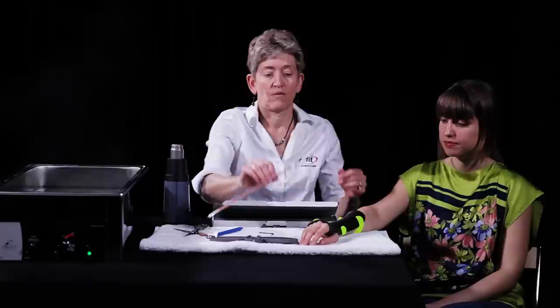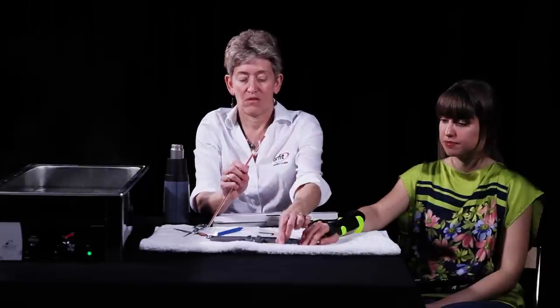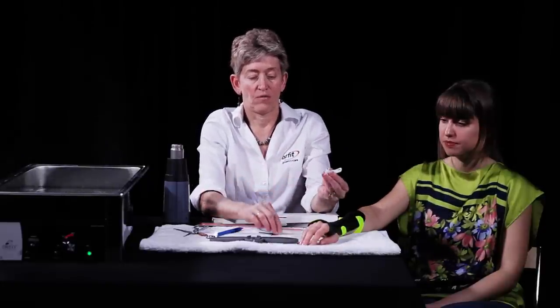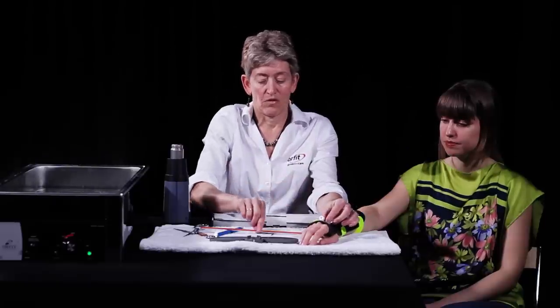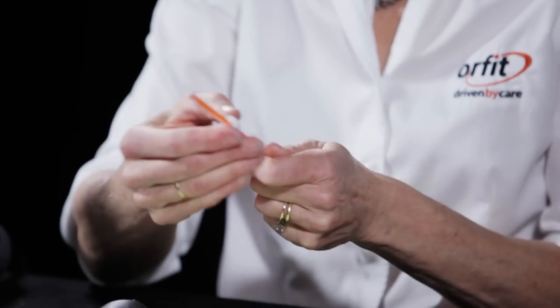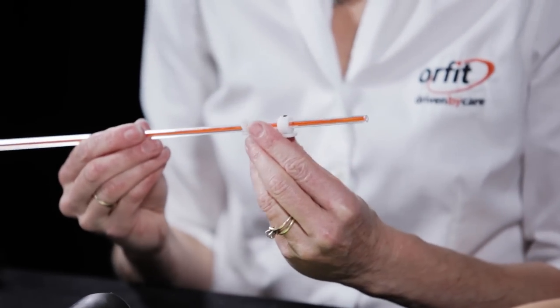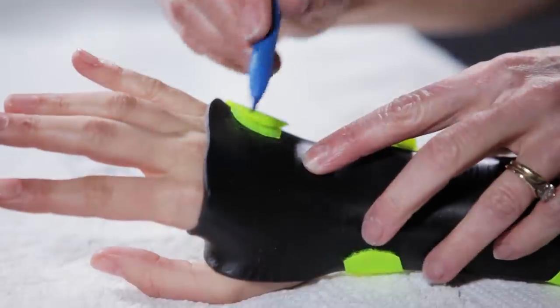An outrigger using the OrphiTube will be added to the orthosis to support one finger in MCP extension. The OrphiTube adjuster will be placed on the orthosis aligning with the metacarpal bone. The OrphiTube fits in this adjuster.